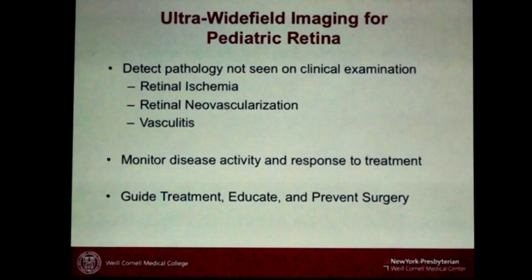So the bottom line is, why are we talking about this? Because we have the technology now, and I think it's important to understand how to use it. For those of us who have these units, very, very useful. I think it's almost indispensable. But again, like Dr. Wah said, nothing really replaces our clinical exam. Nothing replaces indirect ophthalmoscopy, but all of these units and all of these techniques, they're synergistic. They work together. They add information and provide better patient care. And for me, the most important thing is I think it prevents surgery. If I can prevent surgery in a child, that's a victory. Thank you.